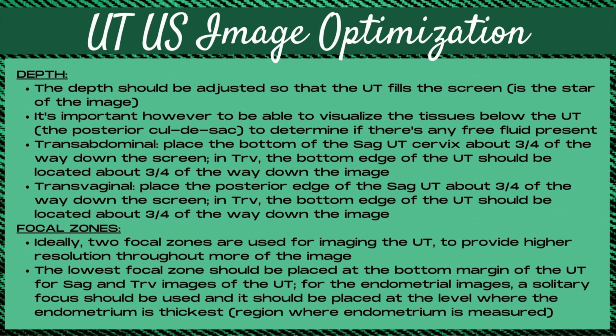To optimize the depth of the uterus, the depth should be adjusted so that the uterus fills the screen, and you want it to be the star of the image. It's important, however, to be able to visualize the tissues below the uterus, such as the posterior cul-de-sac, to determine if there's any free fluid present.